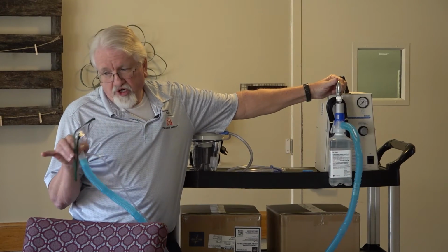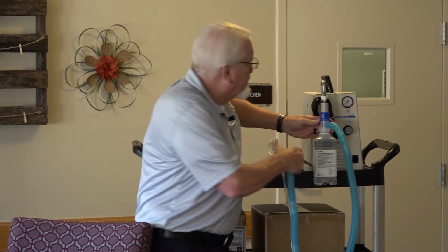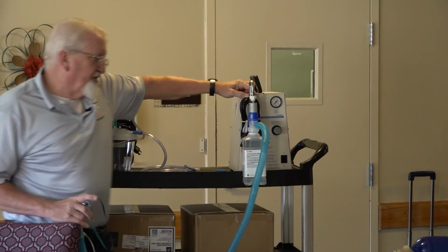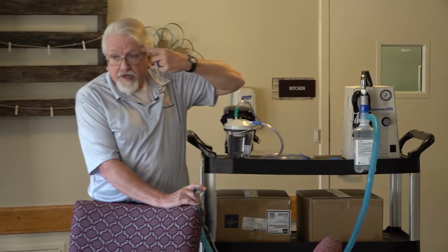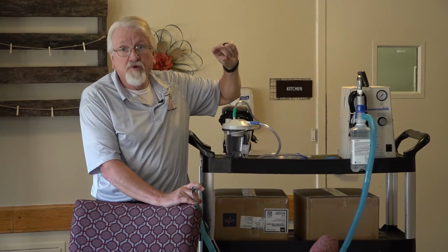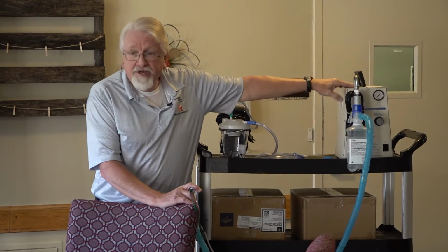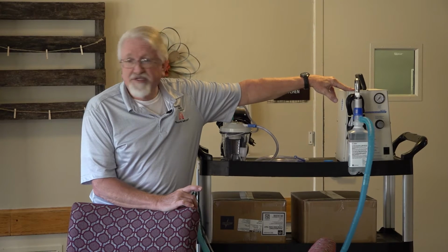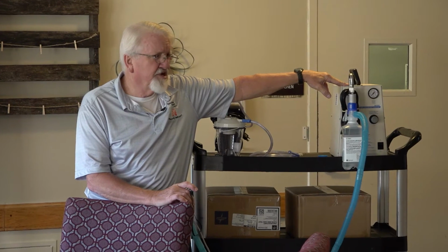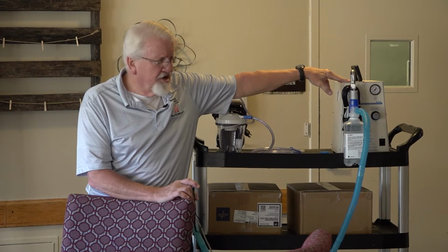So what you see on your chart in there, this is typically going to be set at, is it 70? Right, well, depending. 70%? Yeah. Okay. So we've got it set at 70. And again, we're actually controlling the amount of humidity we're giving this patient. So if you have it set up properly and the patient has a lot of secretions and you're having to suction them a multitude of times during a shift or a day, then maybe we're giving them too much.